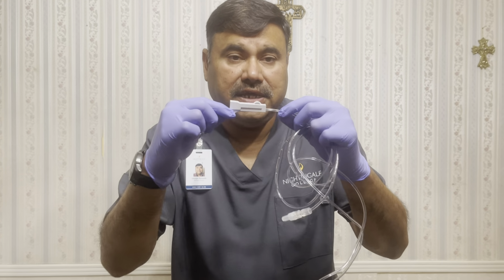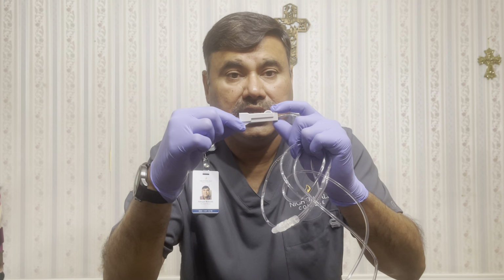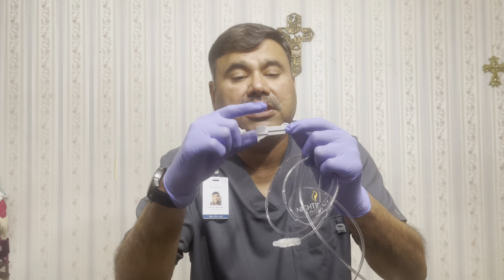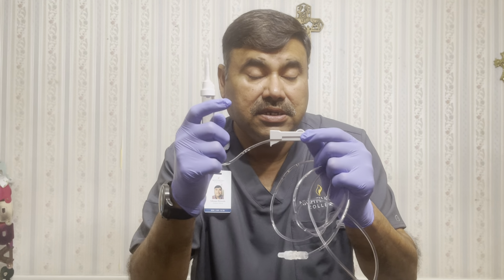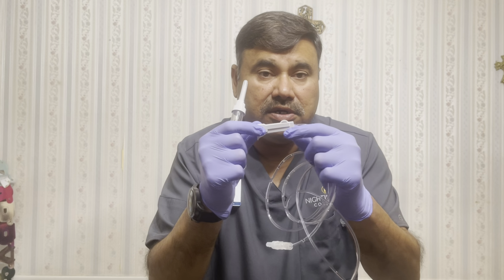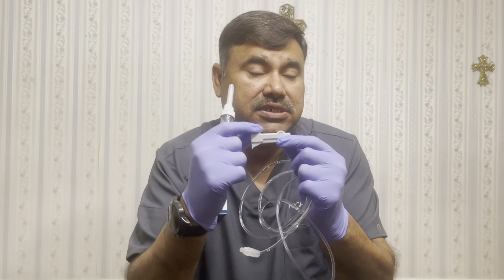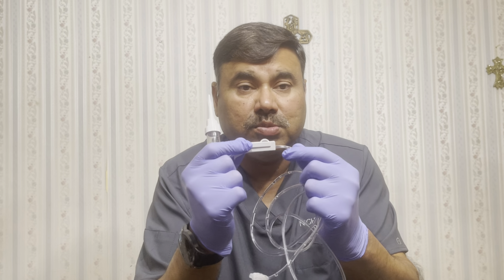So I have the roller clamp. It is all the way down and locked right now, so nothing will be going out. If I move it upwards, like opening it, it will let a lot of fluid flow. So I will be adjusting this while I'm giving my meds to my patient. Then I'll move forward.